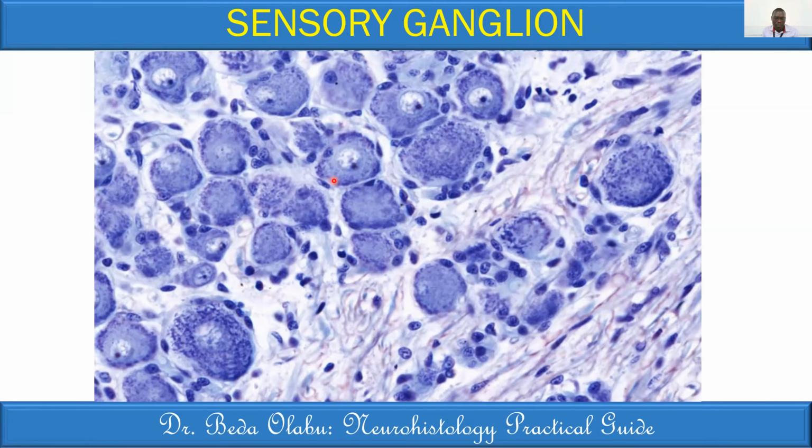I want to confirm that there's a presence of some small cells in the perimeter of each large cell. For example, this one, we can see some cells around it. Even this one, we can see some cells around. So usually, the large cells are surrounded by a ring of smaller cells. Very important to note for a sensory ganglion. A common question we then ask you is, what are the cell types in that sensory ganglion?